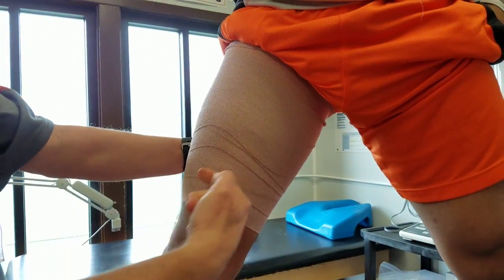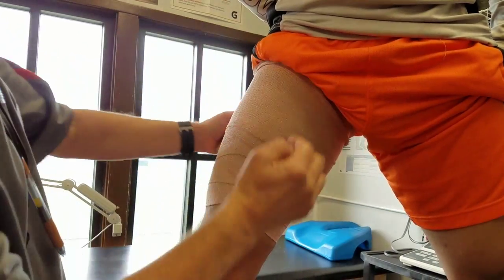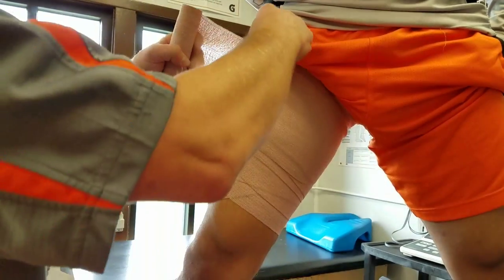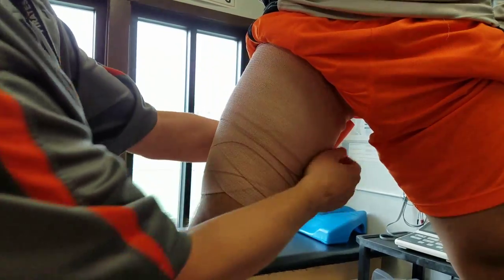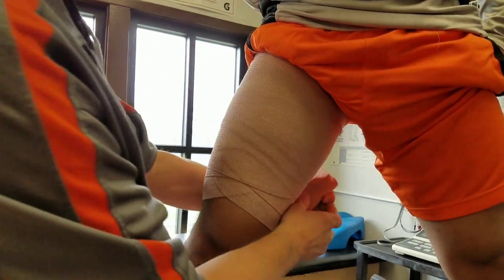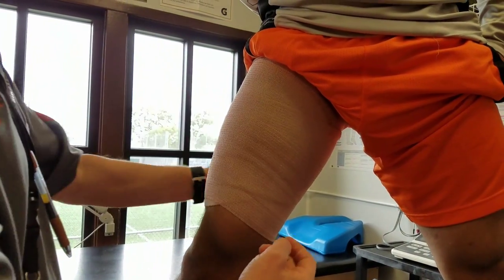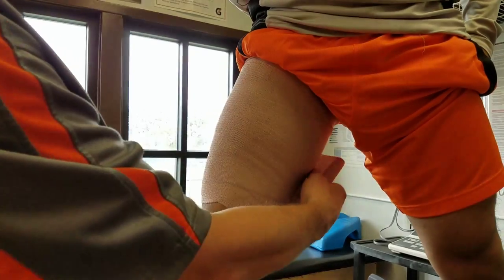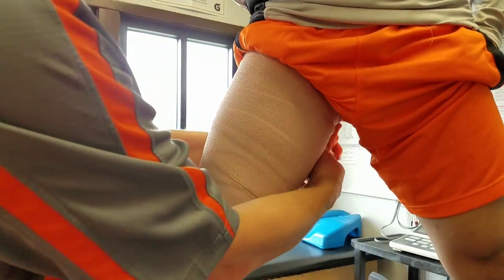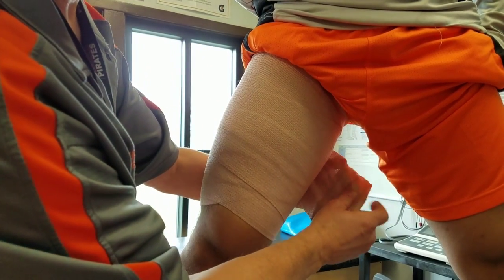You can see that angle down as these are angling upwards. We're going to have more than enough ace wrap here, so I'll go ahead and lightly continue to add a little bit more compression. We don't want to go over the knee because we want the athlete to be able to flex their knee fine. I might have gone with a different size of ace wrap — one not as long.